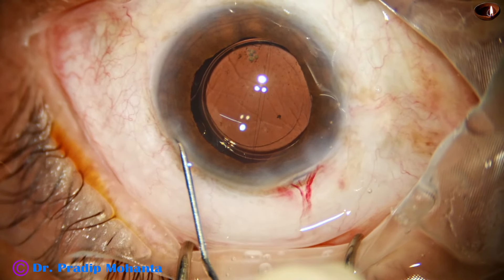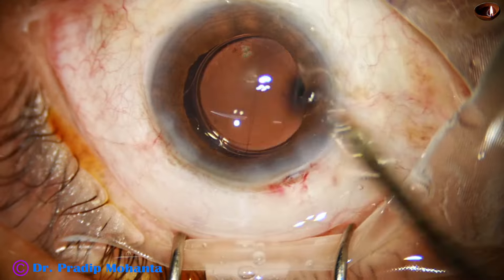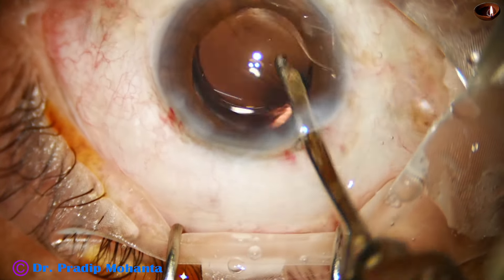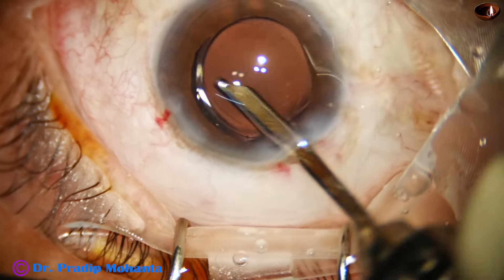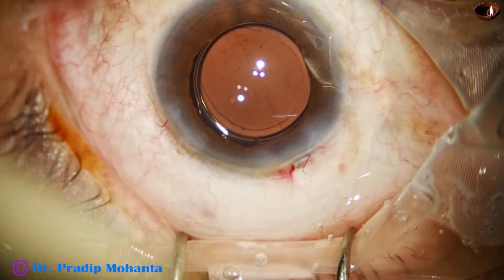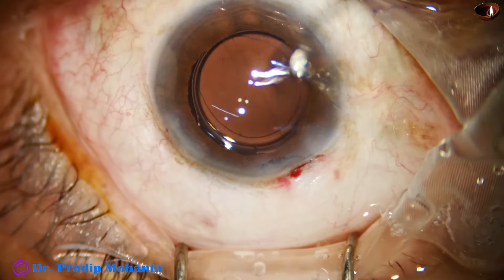As I mentioned, the rhexis is not central — it is eccentric. This is because initially the movement was such that the rhexis would have been very small had I not gone to the periphery towards the five o'clock position. I have now gone behind the lens and am irrigating behind the lens — if any viscoelastic remains behind the lens it will be removed. Now the anterior chamber is nicely formed and a few drops of Moxifloxacin are applied.